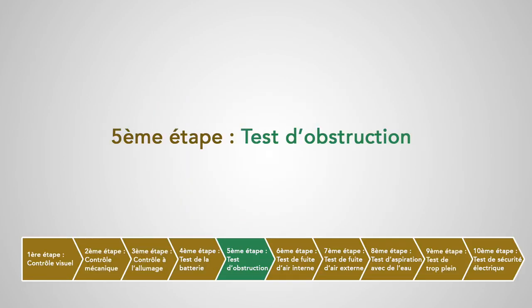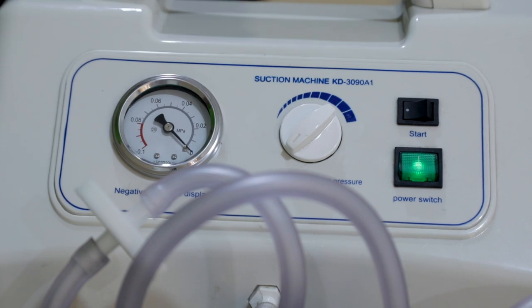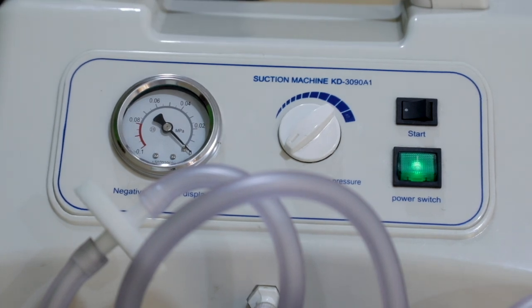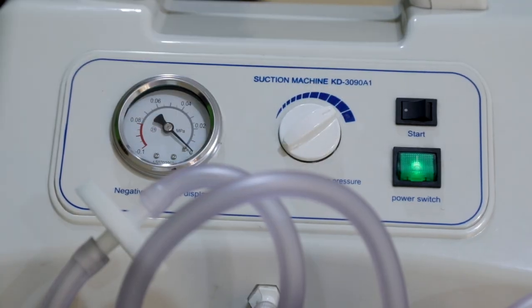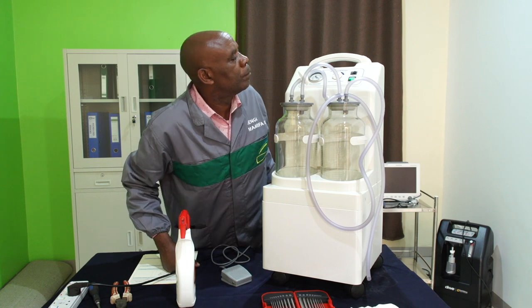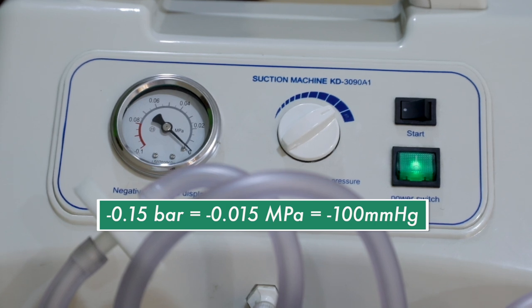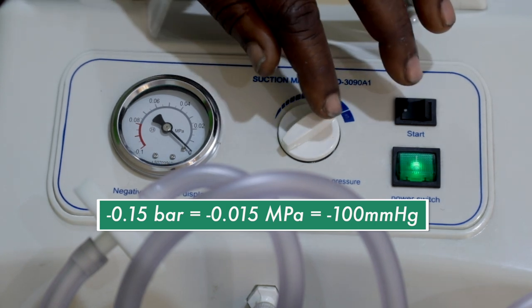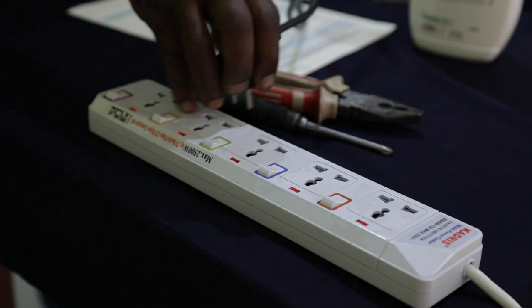Cinquième étape : test d'obstruction. On va régler l'aspiration au minimum et vérifier que le manomètre est à zéro. Dans le cas contraire, il faut changer le manomètre. Ensuite, on va ajuster le bouton de réglage du vide au maximum et vérifier la position du manomètre. La valeur ne doit pas être en dessous de -0,15 bar ou -100 mm de mercure. Si la valeur est en dessous de celle-ci, il pourrait y avoir une obstruction entre les tuyaux d'aspiration et le manomètre. Il faut alors vérifier que le filtre antibactérien et le flotteur ne sont pas obstrués.